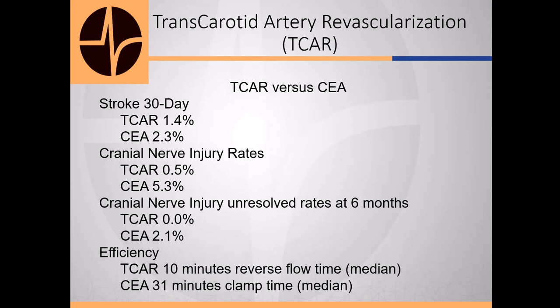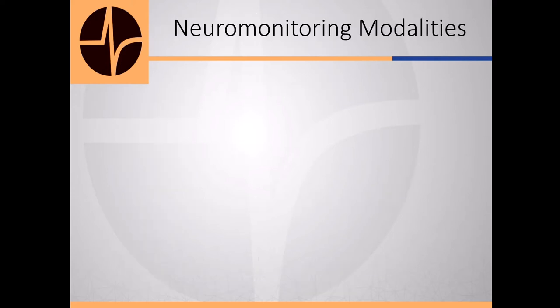Again, you're going to see more and more surgeons using this. The neuromonitoring modalities I'm going to offer are what I saw based on what is done at Hitchcock Dartmouth in New Hampshire, and they do several of these a week. So you're going to do EEG, and they do median nerve SSEPs.